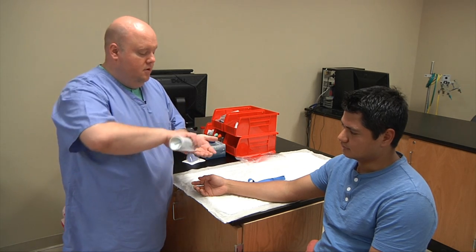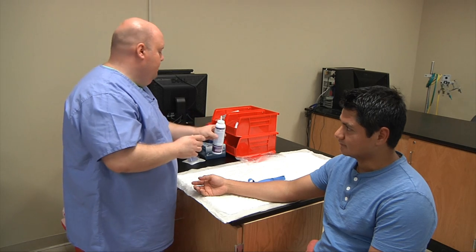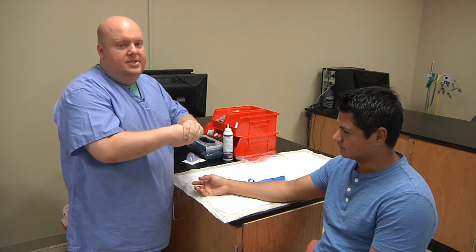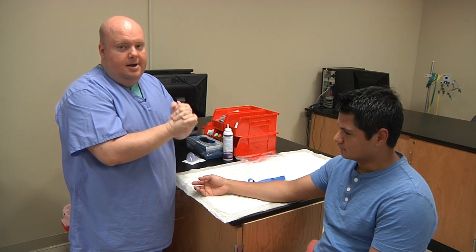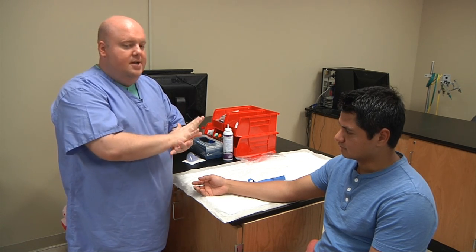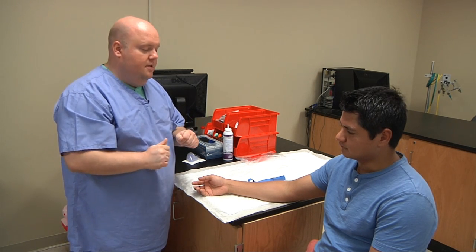First thing we want to do is wash your hands or sanitize your hands. Put a little bit of hand sanitizer in your palm and rub until it's completely dry — about 15 or 20 seconds. If you wash your hands, hum happy birthday twice to yourself to make sure you've washed long enough.